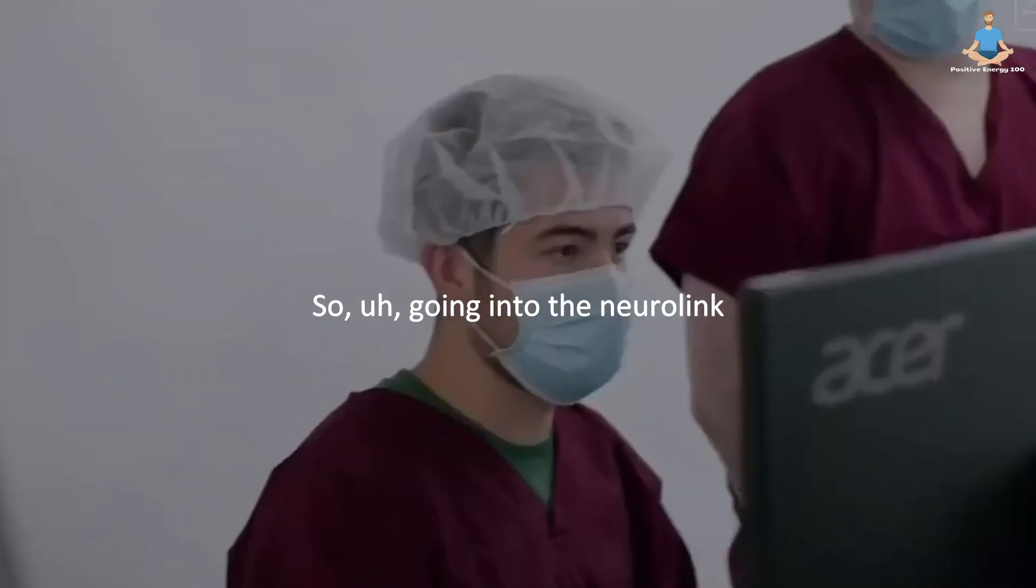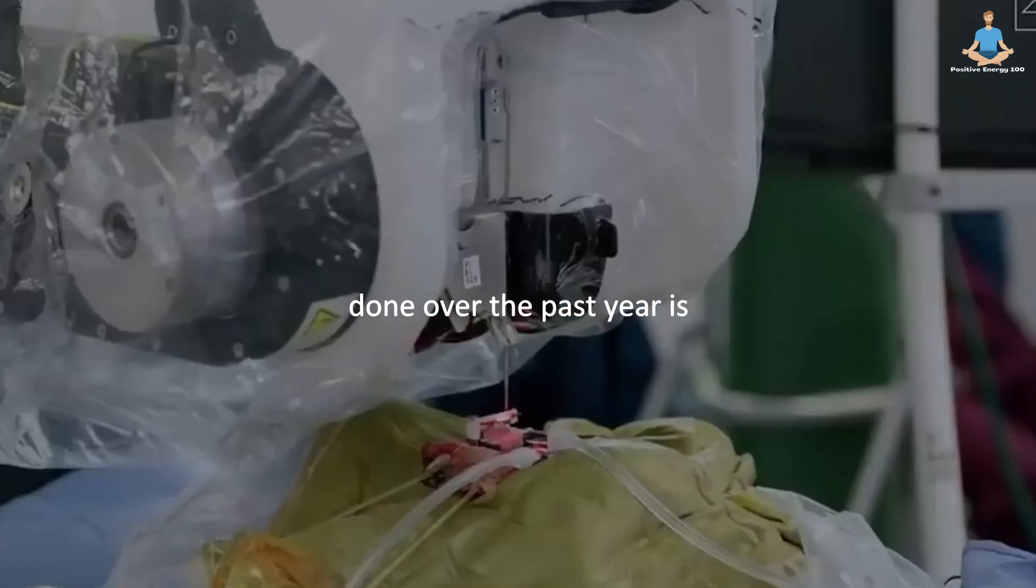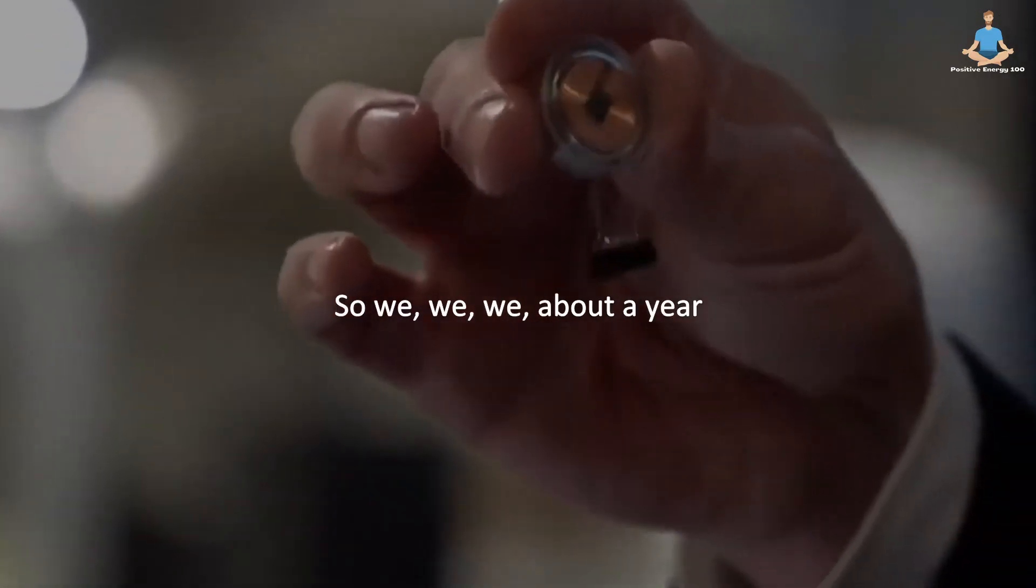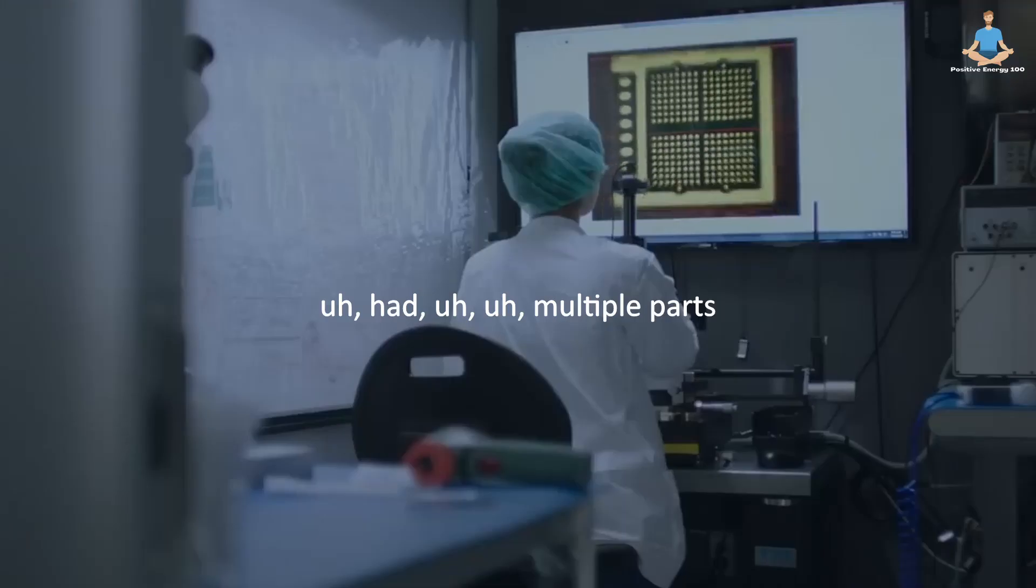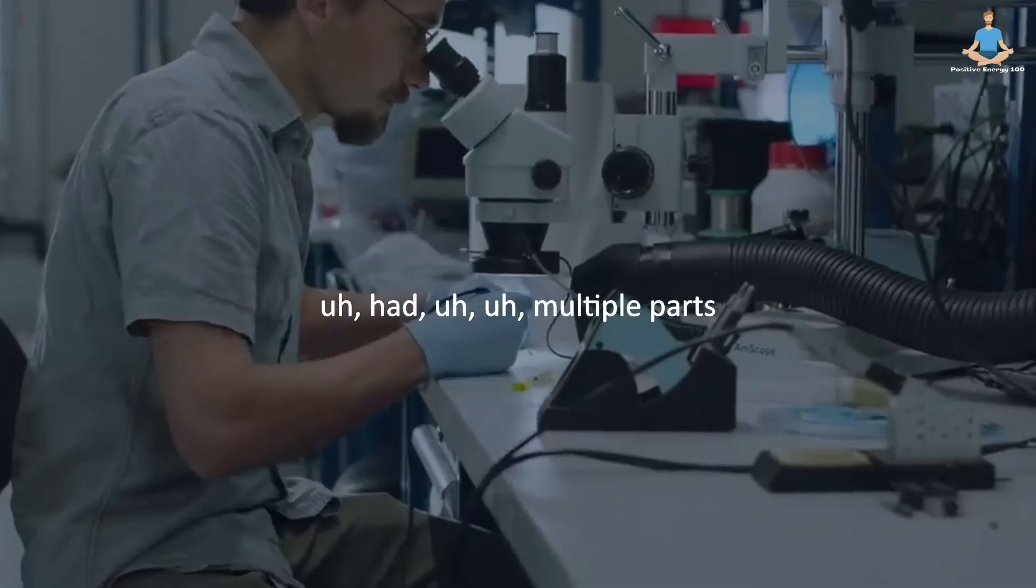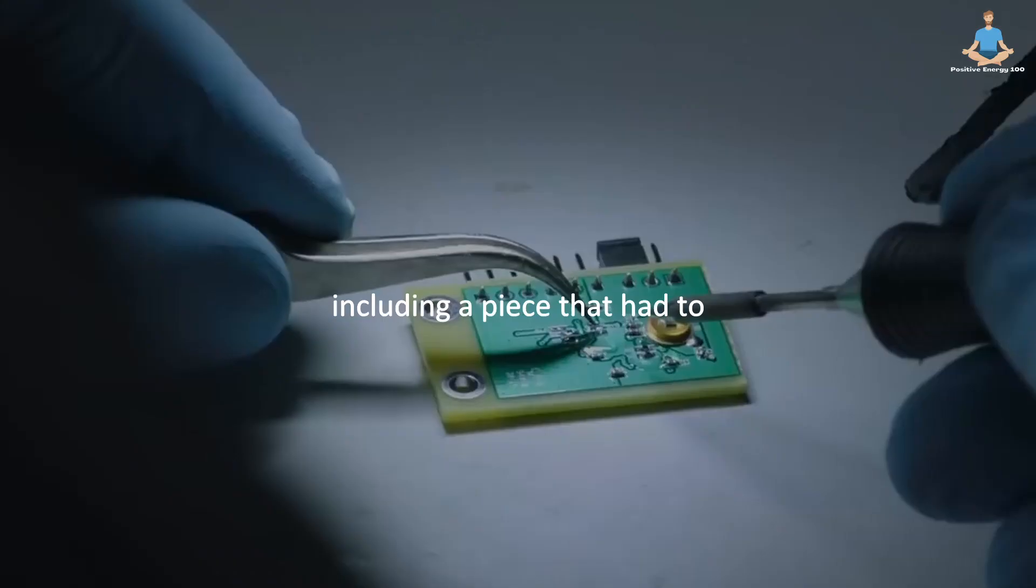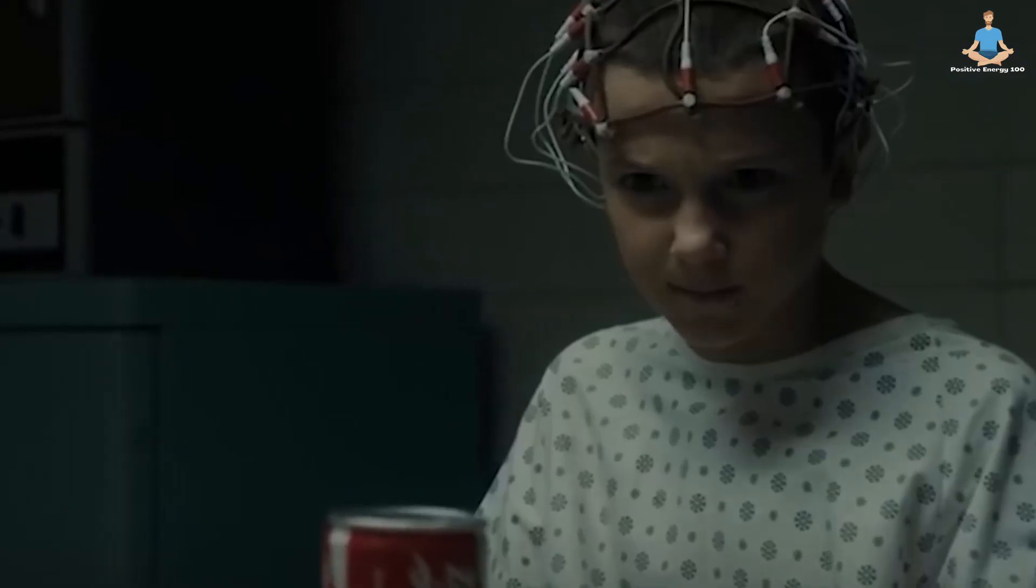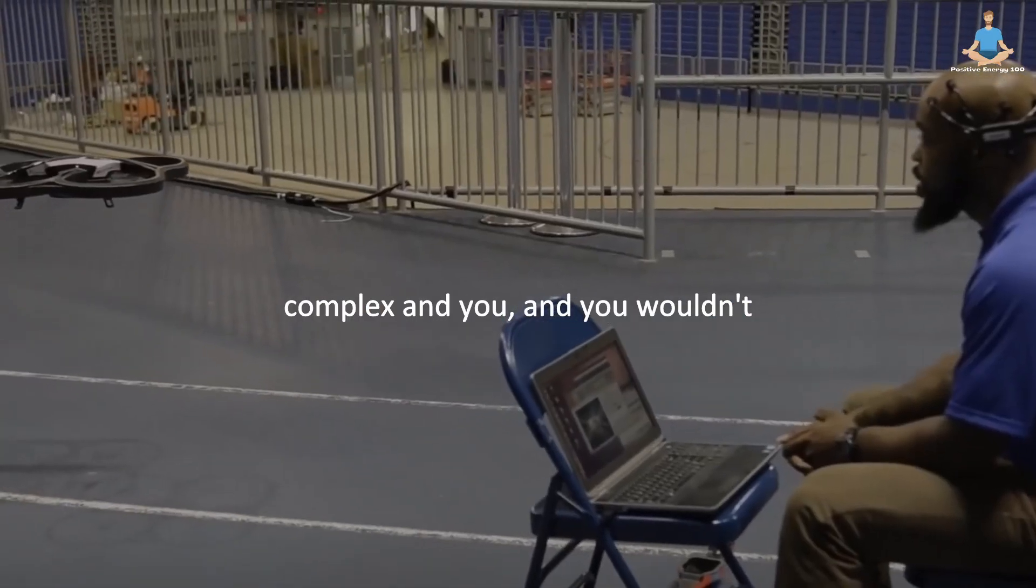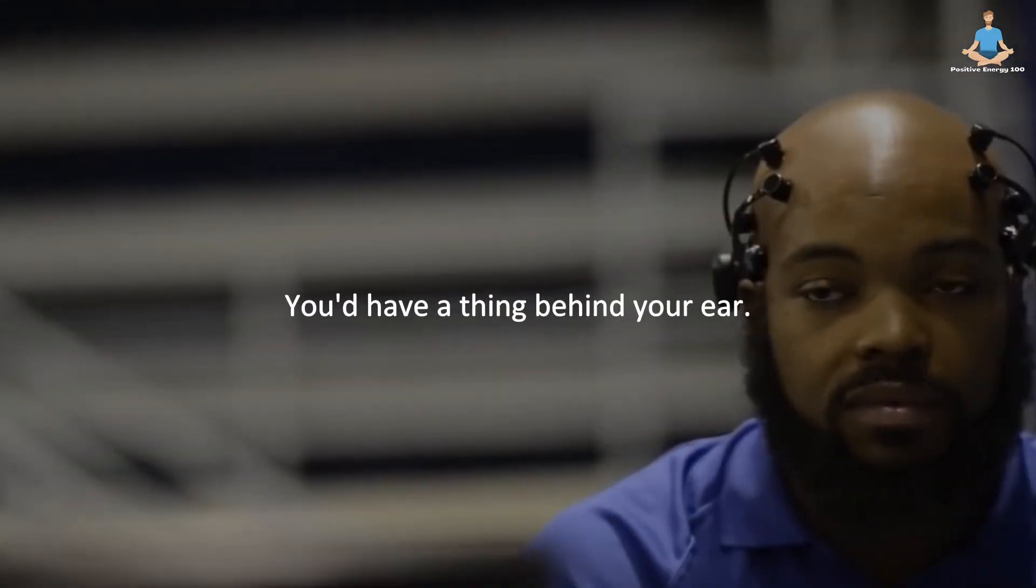So going into the Neuralink architecture, what we've done over the past year is dramatically simplify the device. So about a year ago, we had a device which had multiple parts, including a piece that had to sort of sit behind your ear. And it was complex and you wouldn't still look totally normal. You'd have a thing behind your ear.